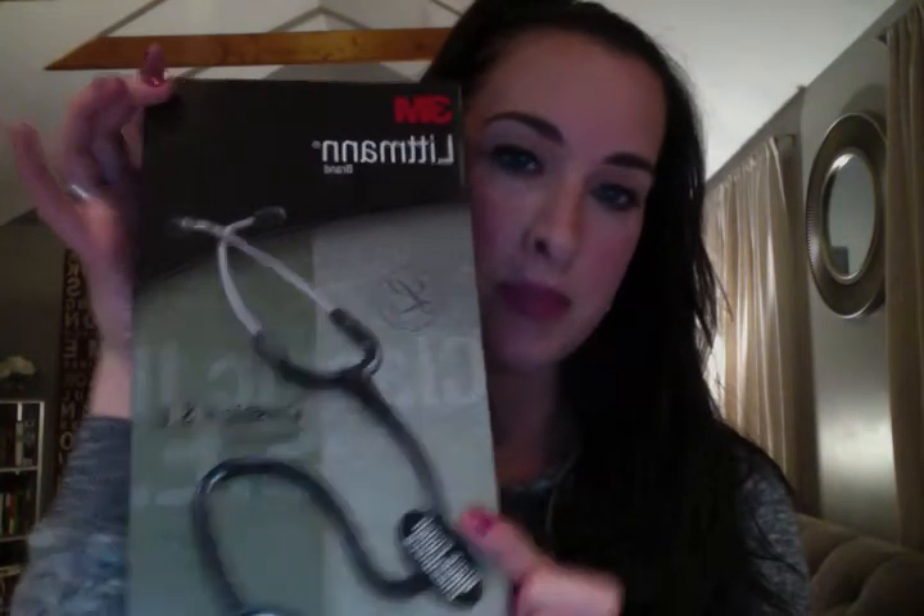The second thing I'm going to talk about is my stethoscope. I got the Littmann Classic II SE. This is the one that my school required. It was around $78 something, and then with tax it was around $80 to $85.